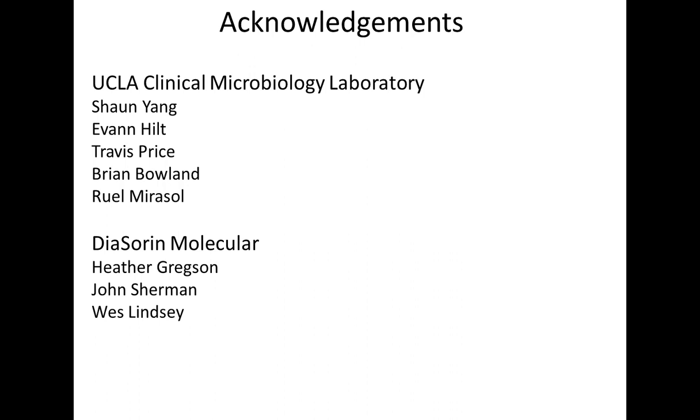Thank you for that. We have time for a couple more questions. Does the DiaSorin primer pair detect all of the clades of Candida auris? Yeah, that's a great question, Sue. The DiaSorin test does. It recognizes all of the clades, but it doesn't differentiate them. They would all show up equally Candida auris positive, but differentiation really requires whole genome sequencing. That's typically beyond the scope of a clinical laboratory, but often can be done in a public health laboratory for epidemiology and understanding where the outbreak came from.